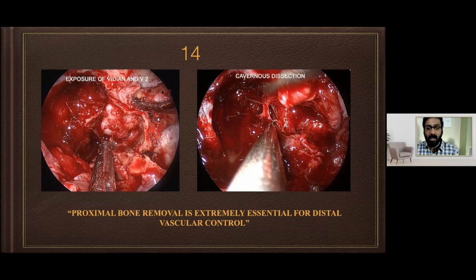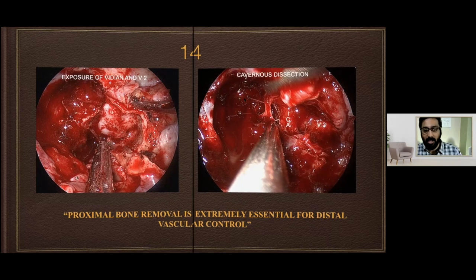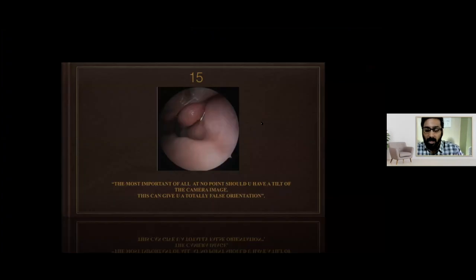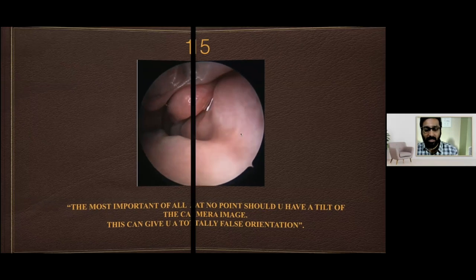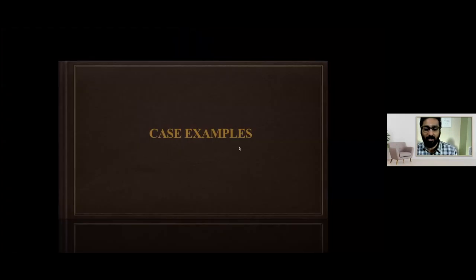So again, the most important thing I want to tell you, my dear friends, never have a camera tilt. If you have a camera tilt, it gives a false sense of perception. So this is all the basics I want to talk to you. And of course, I can show you any number of cases like the cranio, which we are operating.